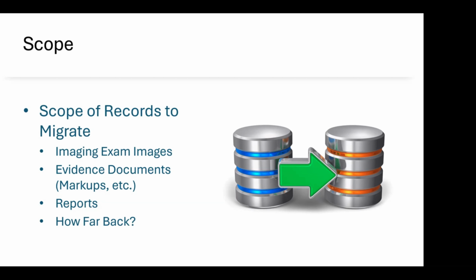You may have people who have inserted interesting cases or teaching file cases. You have to determine, is there a mechanism to migrate those to the new system? I've worked with groups who had a virtual bucket in their PACS of outside telerad cases that they had done overreads for. They wanted to keep them, but they weren't linked to any patient identity that they had in their own systems. But the outside org that submitted the exam is really responsible for long-term archiving. So you have to make a decision: are we going to keep this shoebox of images from however many years back that aren't understood by any information systems, or are we going to purge these? So those are some examples of stuff that you may come across.